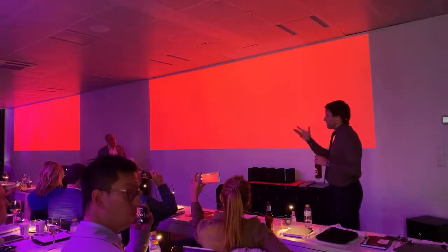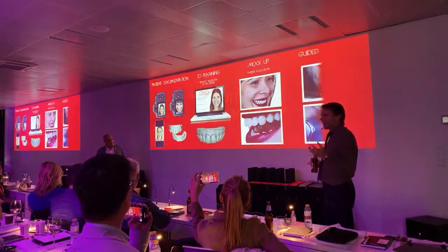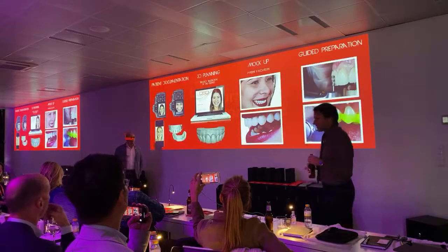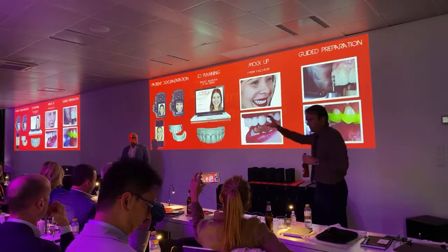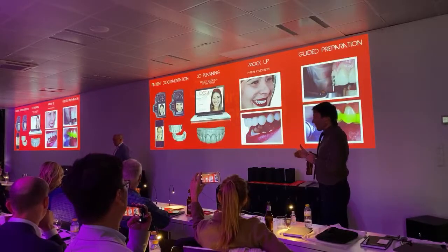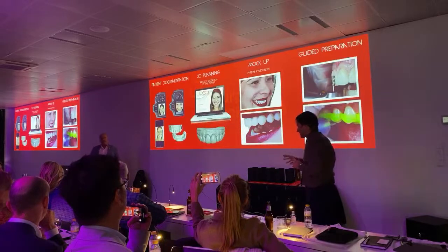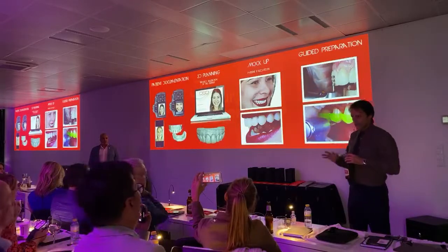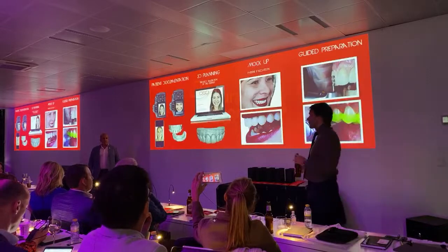So we already have the process of using your scanner as a chair-side quality control, right? We already mentioned, and Angelo will explain how it works, how a prep analysis consultancy works, he's going to explain that. But what we need to start doing much more is to start prepping teeth, ordering the guides. So this lecture, the first part, is about partially guided preparation, and what the guides are, and in what sequence we suggest you use these guides.